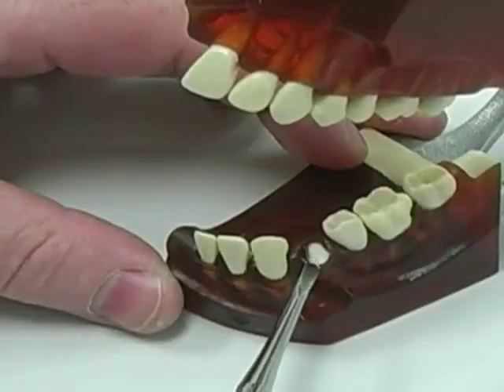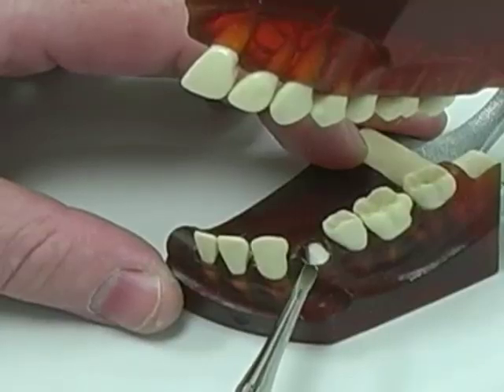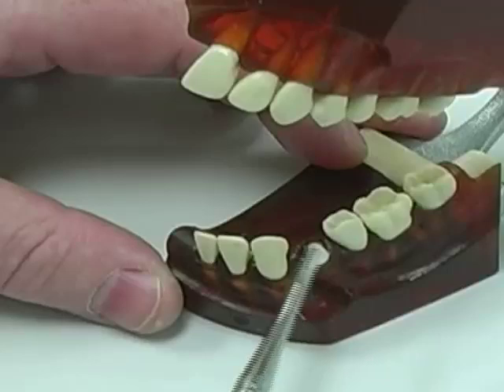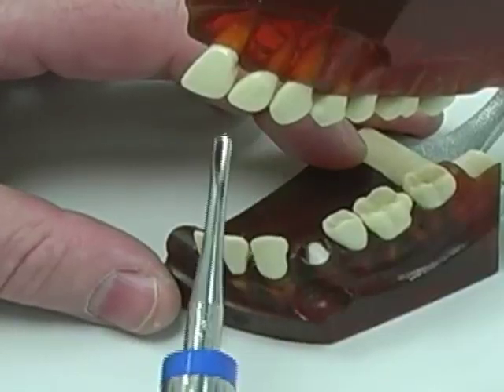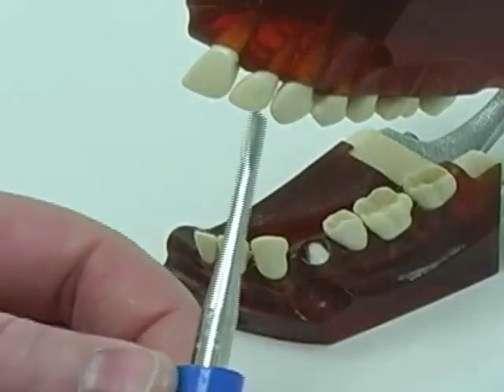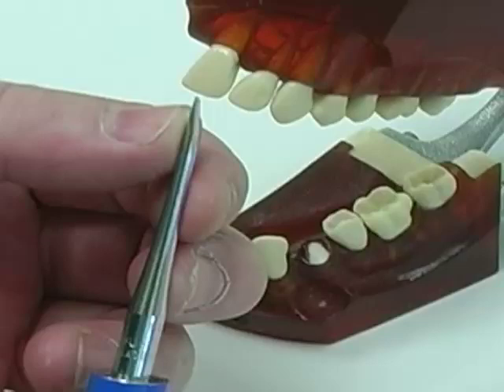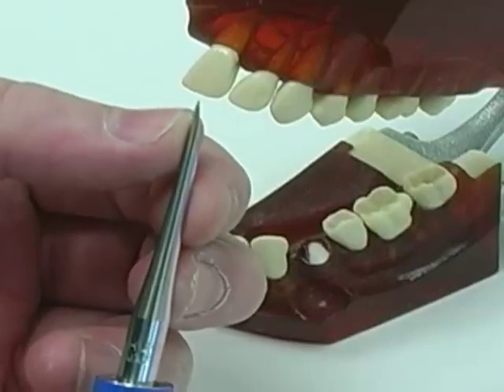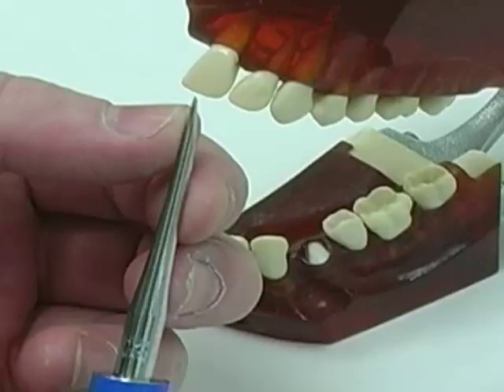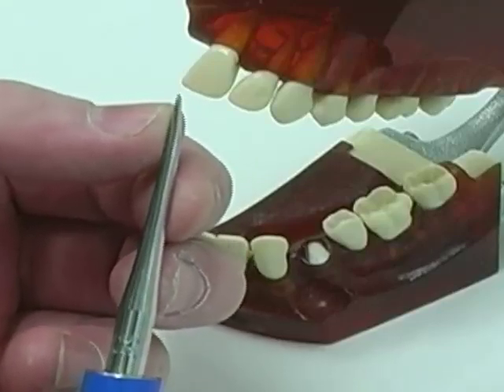Here you see the fractured root well below the level of the gingiva, and here you see the luxator, which you can identify by the blue ring and by its more sharp edge. This very sharp edge can squeeze in between the tooth and the bone, and the instrument is applied vertically.